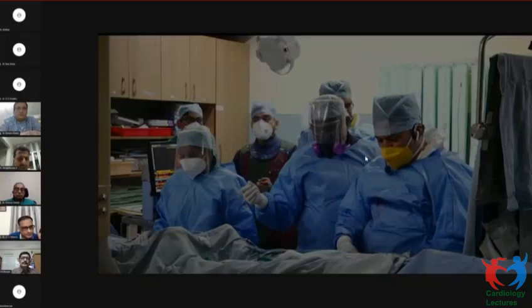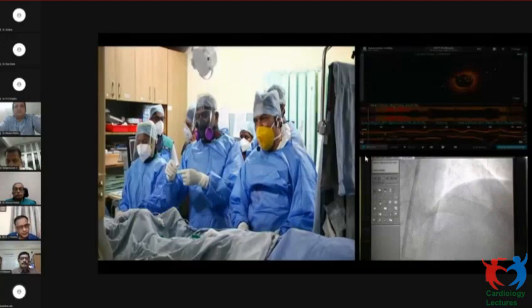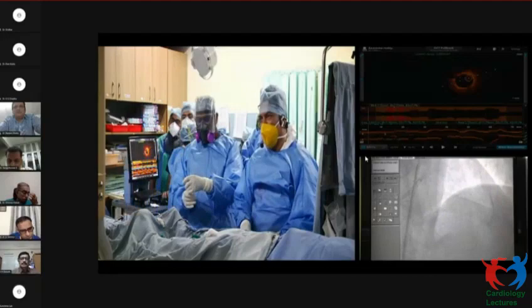I do think so. I don't know. It's up to a significant LAD lesion, LCX diffuse long lesion. I think the validity of the FFR is not certain. If at all we can do the LAD D1 bifurcation, subsequently we can do the FFR. After that, if FFR is positive, if needed, still we can do the left main stenting. That is our strategy. That's okay.